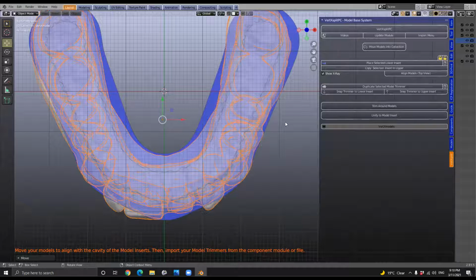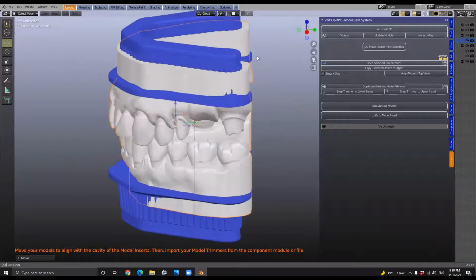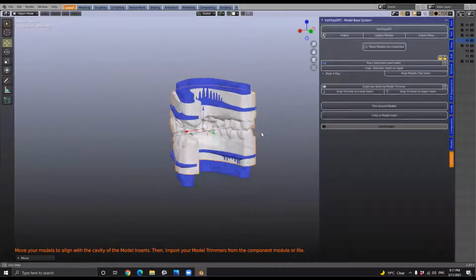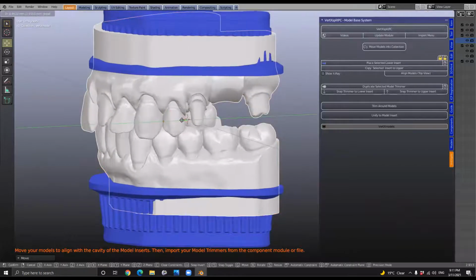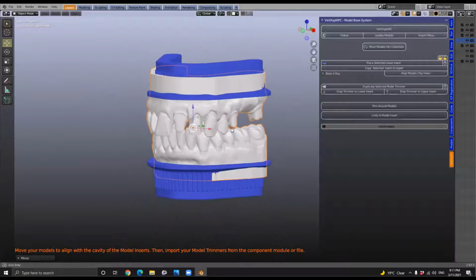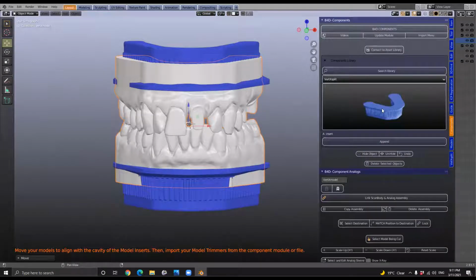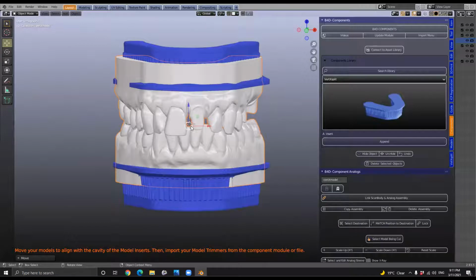But we can take this further, and we can then do this as well. I'm looking at the long axis of the teeth over here, and we can still move it at this stage. We can move it up or down, and the models are all linked at this stage. Once we're happy with this, we're going to bring in our cutters, so we're going to go back to the component module. Okay, so, Michael, maybe take the medium size, because that's got some borders going upwards.